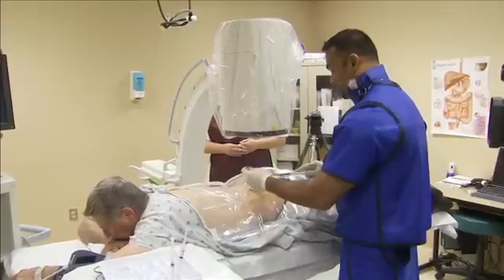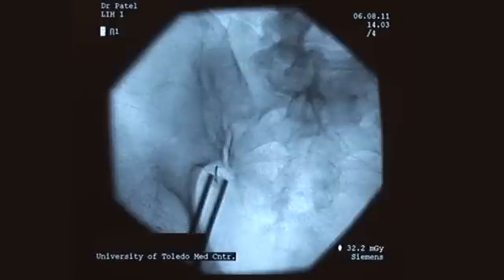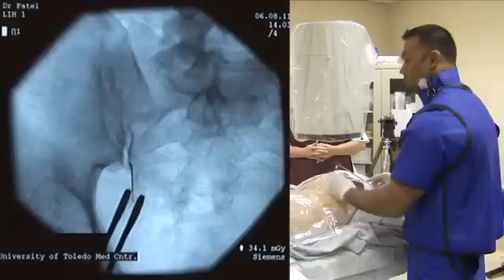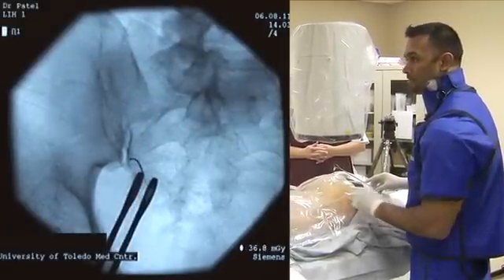The next step is to place the needle over the numbing area, and it should be overlying the SI joint. The needle typically should start at the medial aspect of the joint line, which is what we see in this picture. We poke through the skin, and the needle is still along the medial part of the joint line, which is perfect.